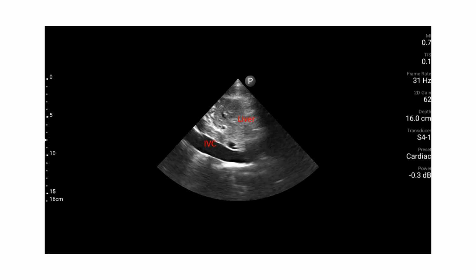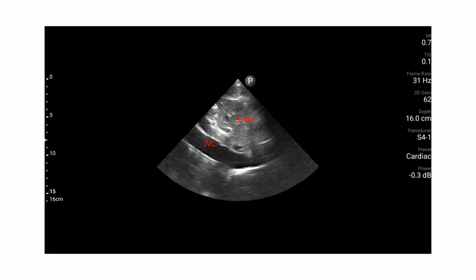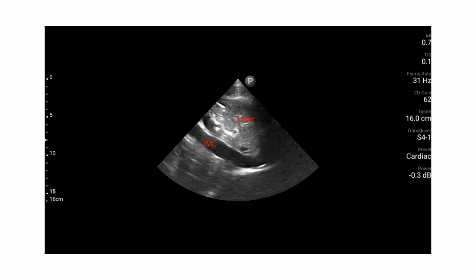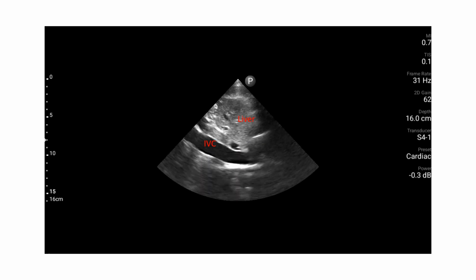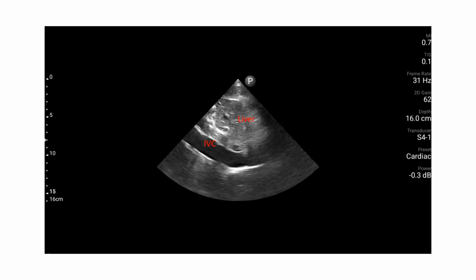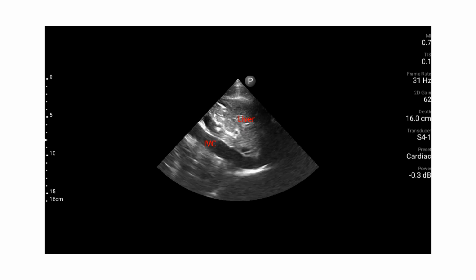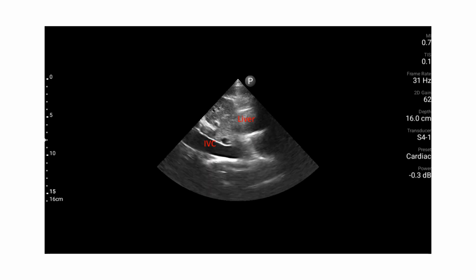So here's a patient. You can see your IVC. Again, the image is flipped. This is one where when you're picking your preset, it kind of depends on what you're doing. So an IVC assessment will often follow a cardiac assessment. And so if you're in a hurry, if you're trying to do this rapidly, you may just leave it in the presetting, depending on the ultrasound device you're using. And so this is a cardiac. This probe was left in a cardiac preset, but again, you can still clearly see what you need to see there.